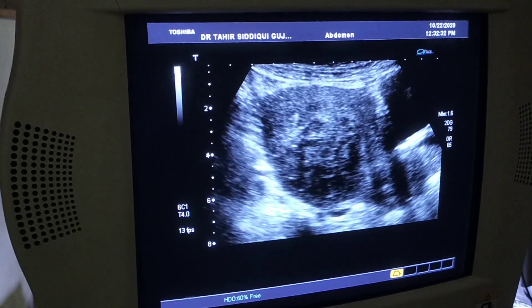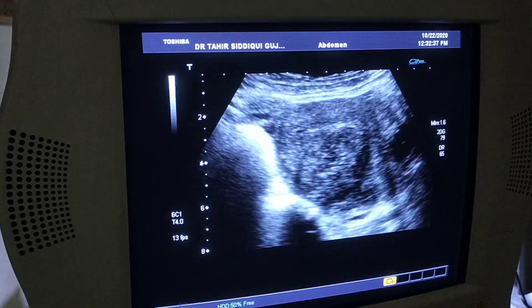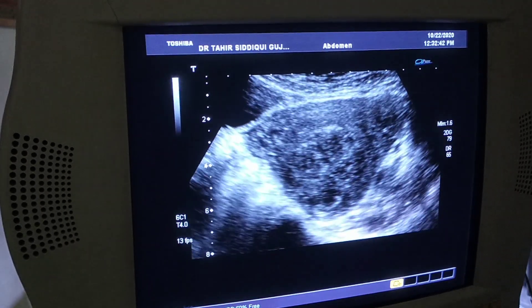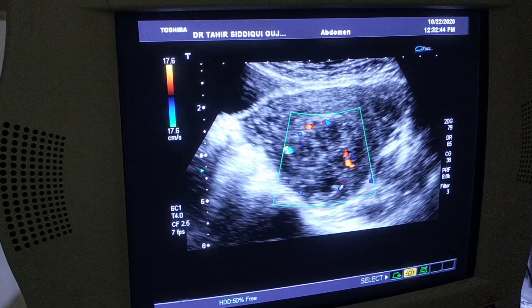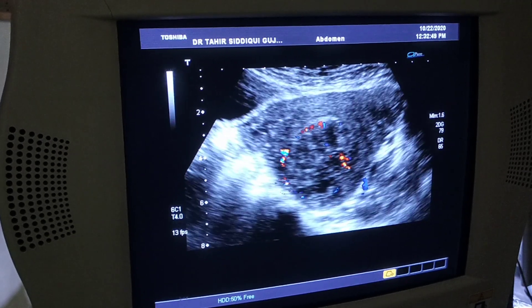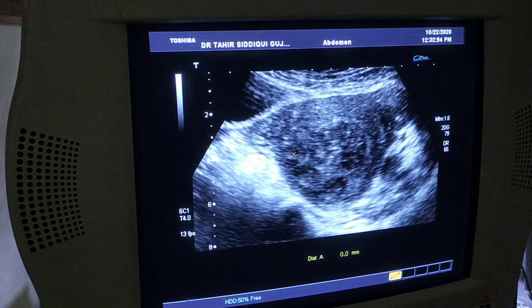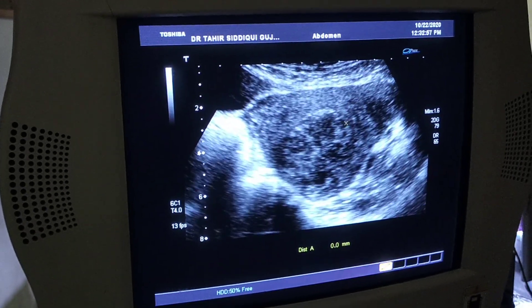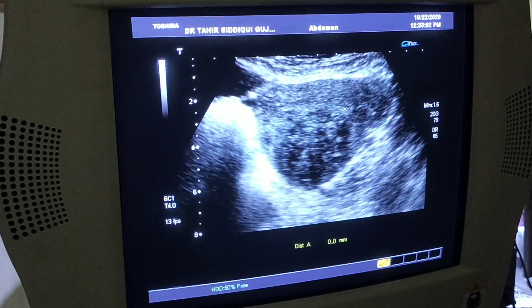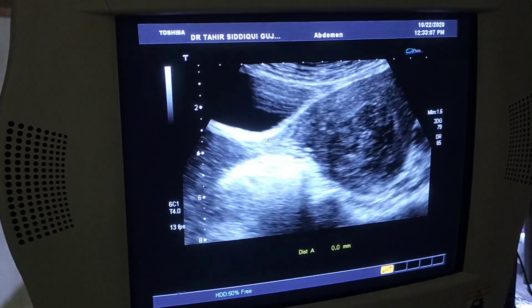The uterus is enlarged and bulky because of this fibroid. Now I'm going to move the probe transversely. You will see that this is the fibroid with the rim of vessels, heterogeneous in appearance, outer surface well demarcated. This is the endometrial canal. There is no history of menstrual disorder.